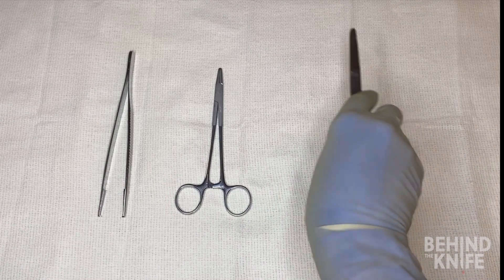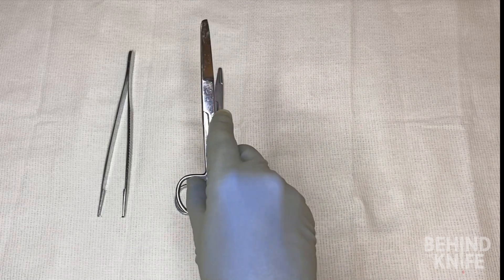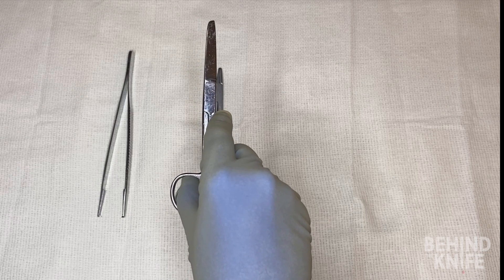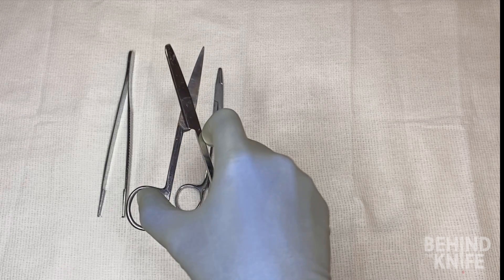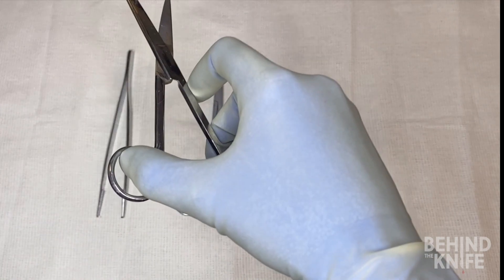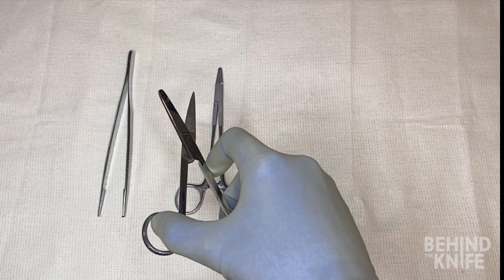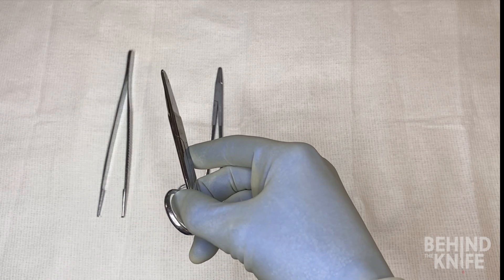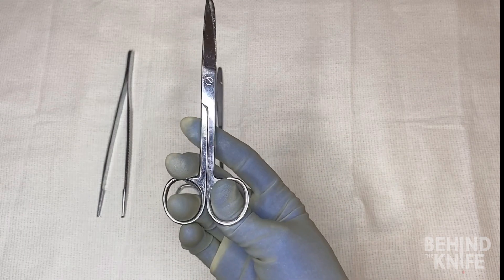Scissors may seem a bit self-explanatory, but there's actually a good way to use them in the operating room when it comes to cutting suture. When you're unsure how long to leave the length of suture, you can always ask, but generally you can use the opened edge of the scissor to slide down the suture until you hit the knot. Once you feel that knot, turn the scissors 45 degrees before cutting, which should leave you with about a one to two millimeter tail each time.